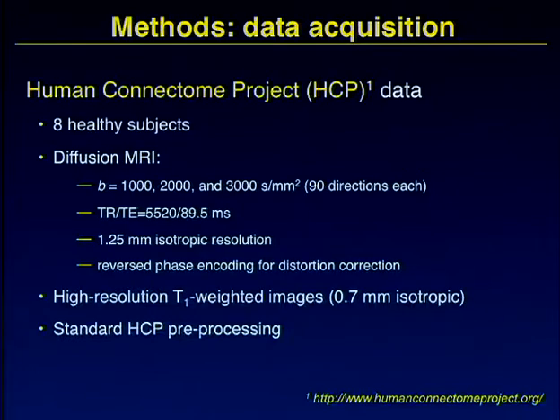So regarding the data, this is not standard data. It's data from the Human Connectome Project. This is a big NIH-funded project that, in simple terms, has a normal clinical standard scanner like the ones in Melbourne, but they improved it and they have huge powerful hardware. So if you take, I don't know, a car, a Toyota Corolla, and then you stack a V8 engine, it's that kind of thing. You can't compare it with a standard clinical scanner, but the shell that they are using is the same one.